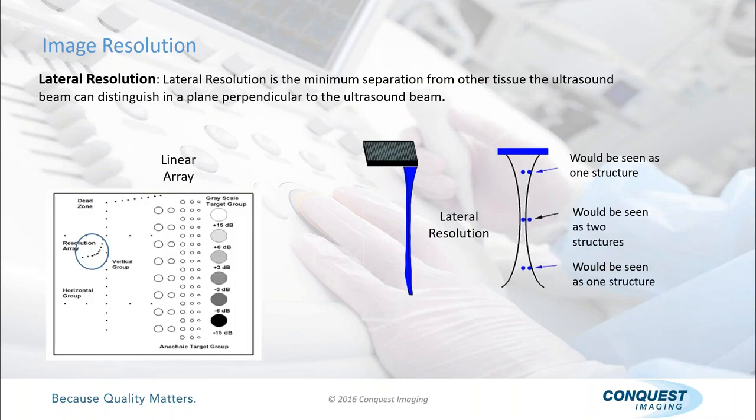Then we have lateral resolution, left to right, means side by side. It shows two objects again, right in the middle where we're focused. And these curved black lines represent where we are focused. They're not real, they're just telling us in this representation that we're focused right here. So when we focus in that area, we're going to be able to see the two dots independently. But when we move into the far field or too close in the near field, they're blurred together as one object. Okay.